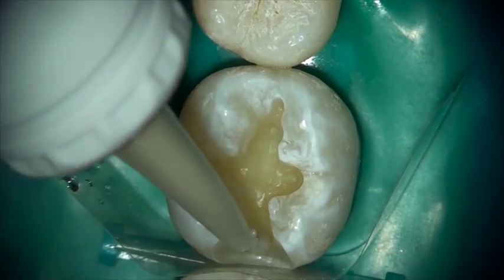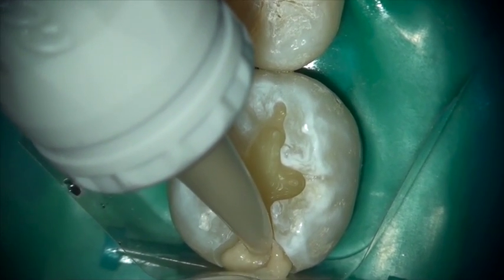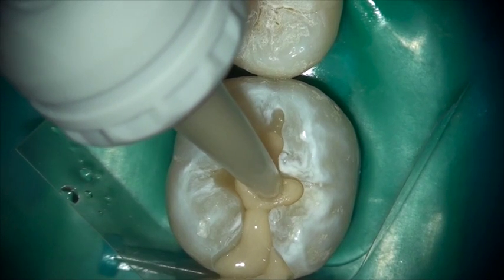Notice how easily Equiaforte flows into the tooth. Every small nook or cranny of the preparation is easily filled by the flow characteristics of Equiaforte.